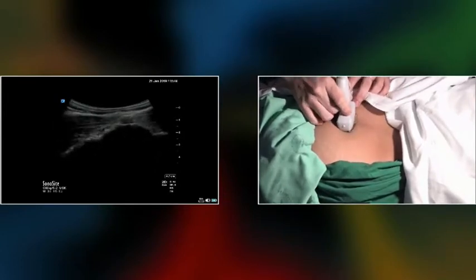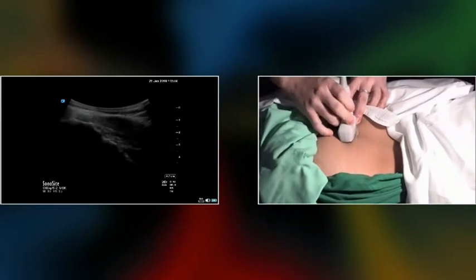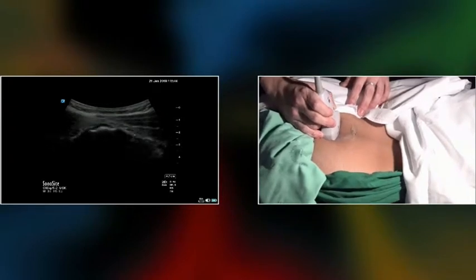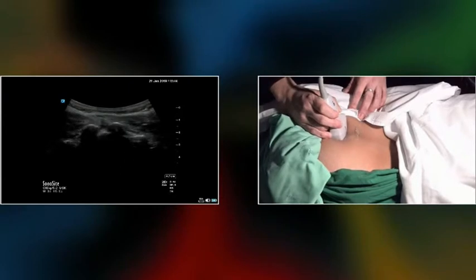And then orient the probe. So now left is left and right is right. And you can scan up and down and try to find the happy frog. Looks like I found one here. This is a happy frog. If I go down, I'm just gonna see only a white thing, right? The single white plate there, that is the coccyx. So turn back to the happy frog.